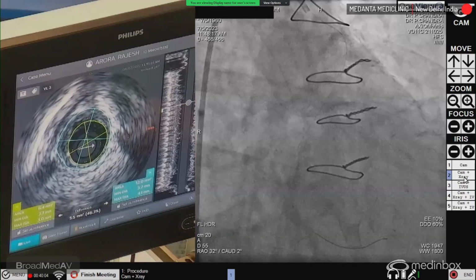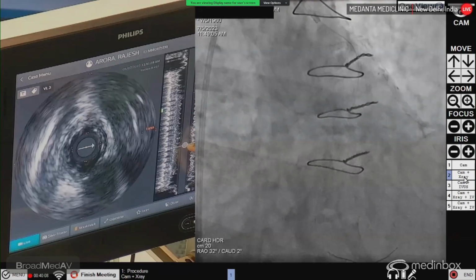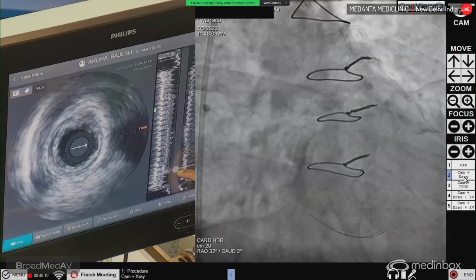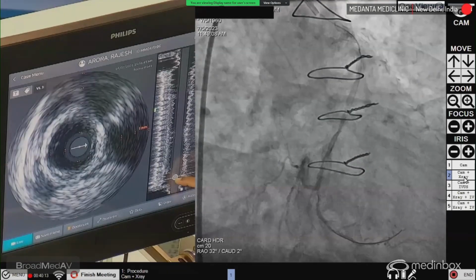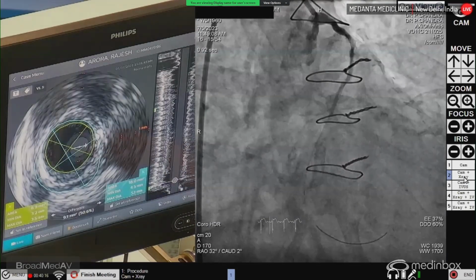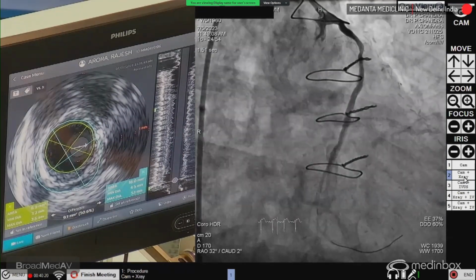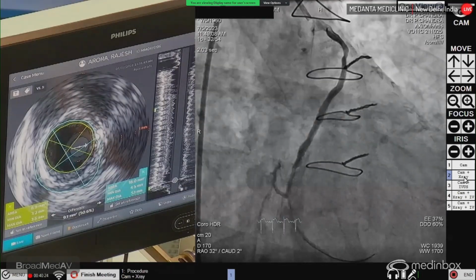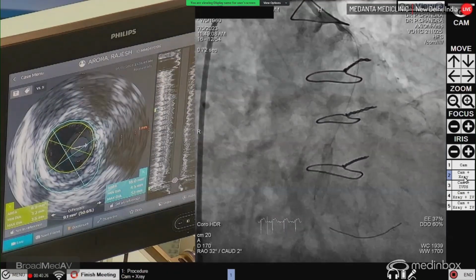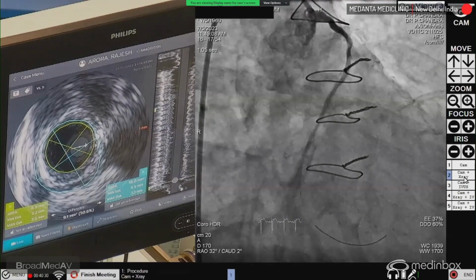So maybe it was a little bit of thrombus and degeneration, which was there. Yeah, the lesion looks much better, but we will give some nitroglycerin at this stage. And we can take a short stent, maybe a 3 millimeter, because we still do not have as much information about drug-eluting balloons in these situations.